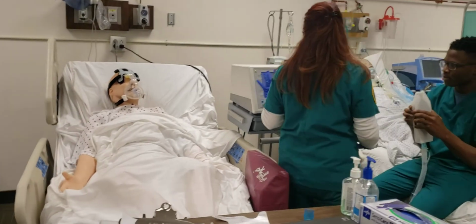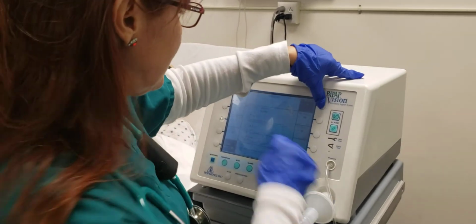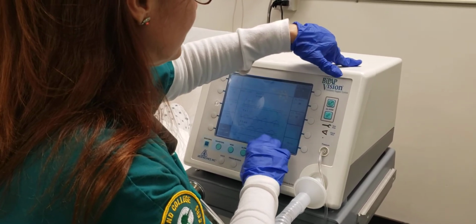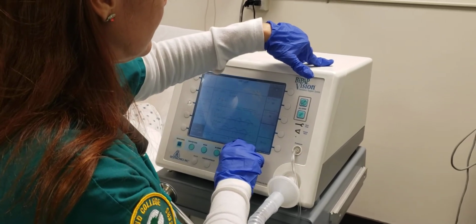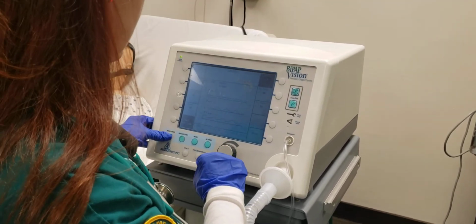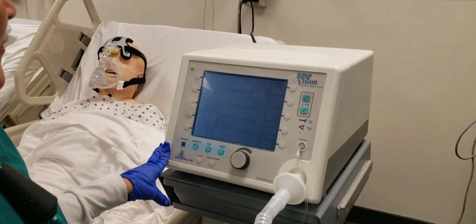So we come back over here to our alarms. The minute ventilation is running at a 9. So I'm going to set this to a 20%. Let's go down to about, I'm going to go 3. All right. Alrighty. And then we have this all set up on the patient.